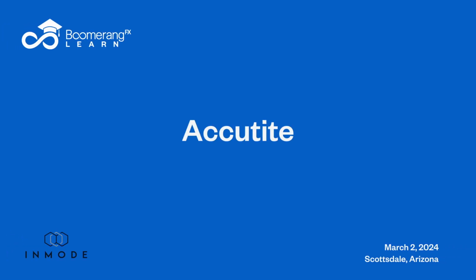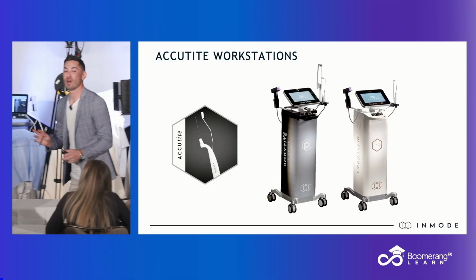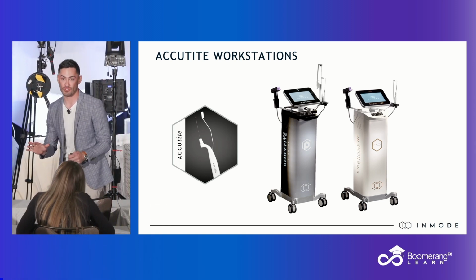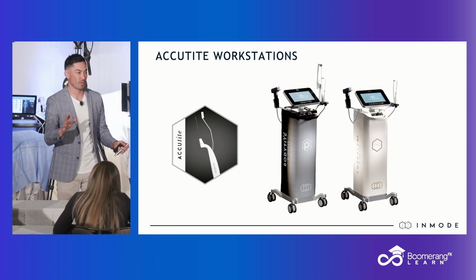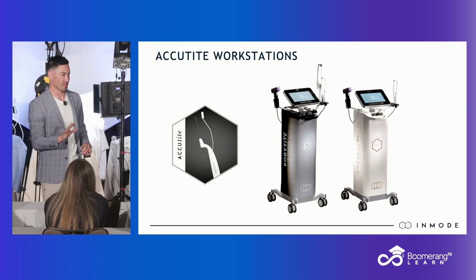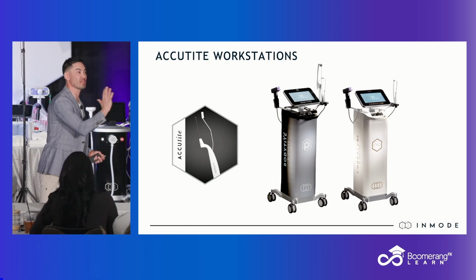AccuTite. This is the little odd player of the bunch because it's like, where was this thing useful for? It's tiny. Where can I use it? I love this one. So this is a gross generalization. Hang with me. But if you think about my face type, that's typically the person who is in facelift territory. I'm not saying it has to be. I'm just saying usually. This is the other end of the spectrum.